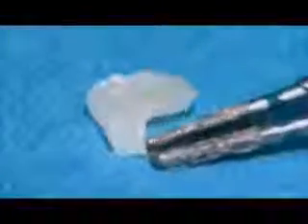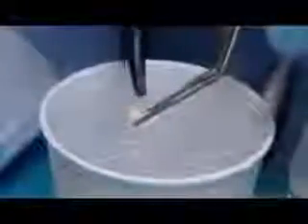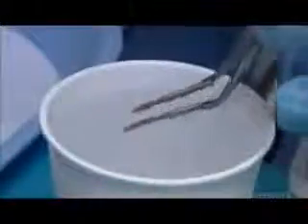The dentist then pulls the ceramic inlay from the base. This leaves a small nub, which he then grinds away. Next, using rubber wheels and diamond-impregnated brushes, he polishes the entire restoration to a high gloss. He conditions the inlay with hydrofluoric acid to prepare it for adhesion to the tooth. He dips the filling in water and the hardened solution flakes off. He then thoroughly dries the inlay.